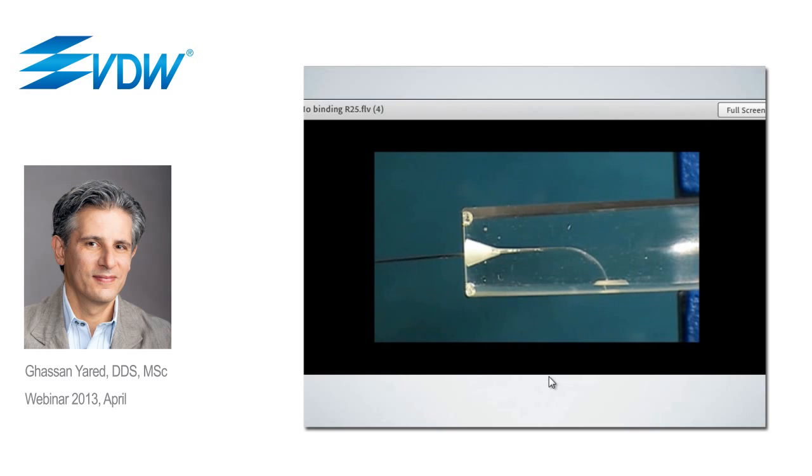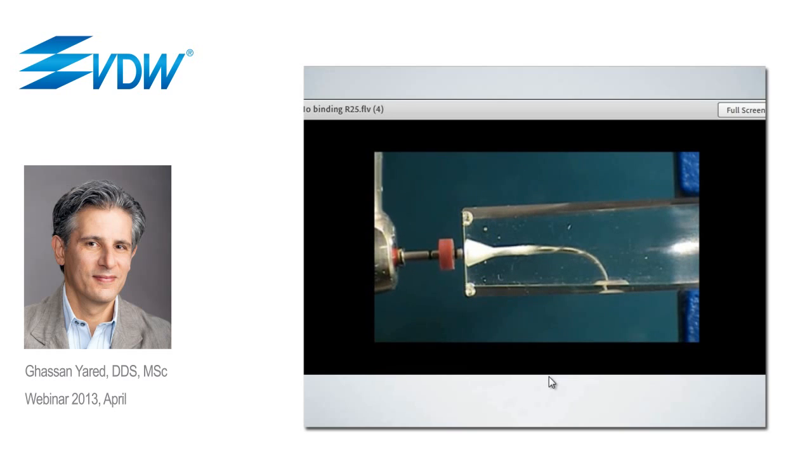And this is done with a Reciproc instrument. So the irrigant is placed in the canal, and now you will see the Reciproc instrument being used in one shot from the coronal orifice to the apex, without removing the instrument from the canal, without cleaning the instrument, without checking the patency. You know that you cannot do this with any other instrument. And this is possible because, one, binding doesn't happen, and second, because torsional fatigue is theoretically eliminated.